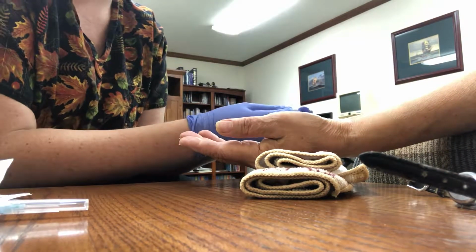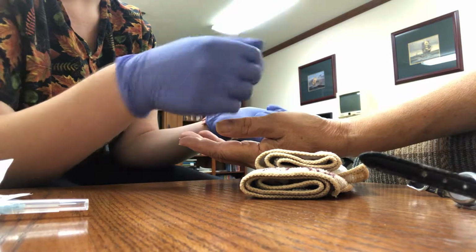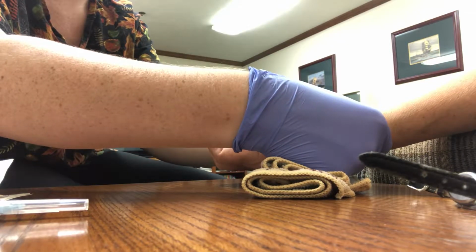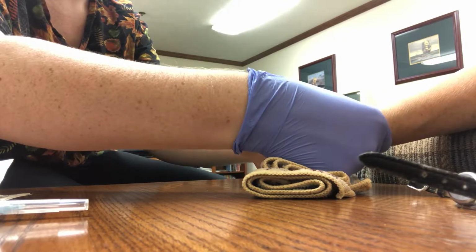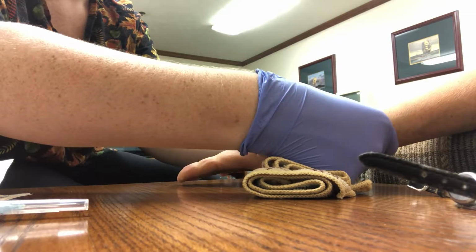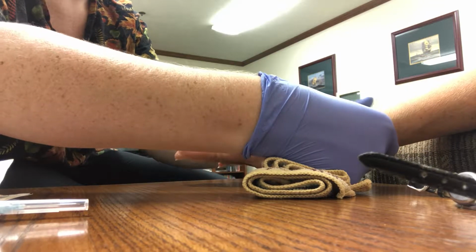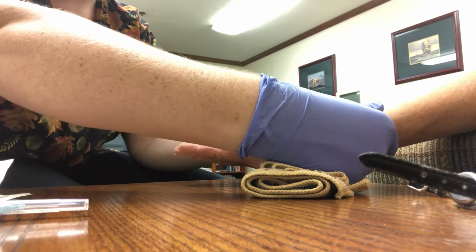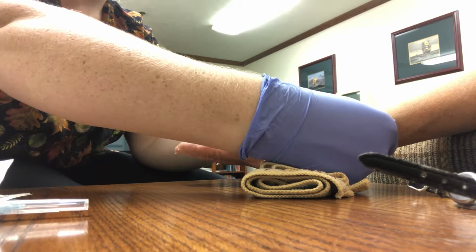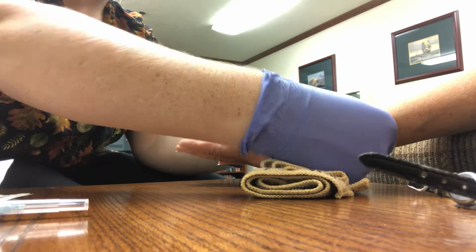And then before I actually would do the poke, after I found your wrist, I would do what's called the Allen's test. And so what I would do is I would have you make a fist for me with this hand, and then I would occlude both your radial and ulnar arteries. Okay, make a fist. Now open, fist, open, fist, open. See how your palm's white? Mm-hmm. When we release the ulnar artery, when you see the color come back to your hand, that is telling me that you have enough blood flow for us to do this procedure. And so that's why we do that test before a draw.